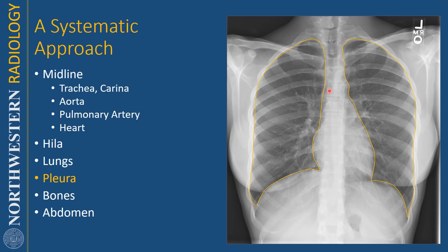Next I look at the pleura. The first thing I do is look for a pneumothorax, which is an abnormal air collection between the visceral and parietal pleura. In a patient who is standing up or sitting up, air is usually going to collect at the lung apex. Then I follow the pleura down, making sure there are no undulations — that could indicate either a loculated pleural effusion or perhaps a rib fracture. Then I follow it down to the costophrenic angles, where the diaphragm meets the chest wall. This angle should be sharp — if it's blunted or there's a meniscus, that is a sign of pleural effusion.